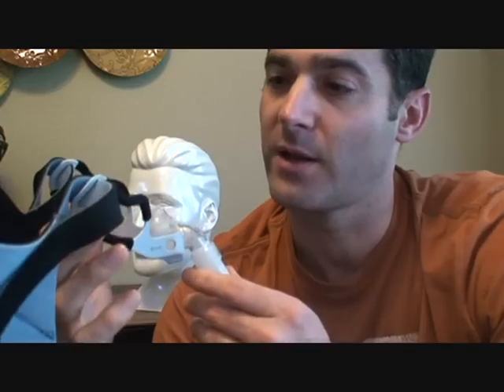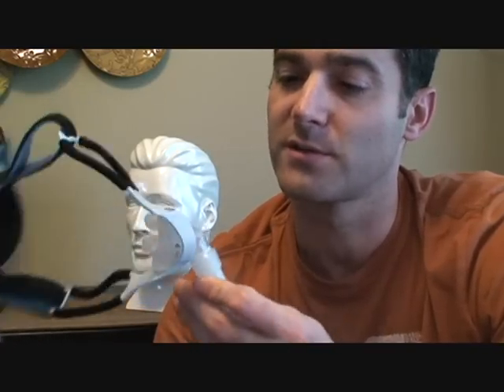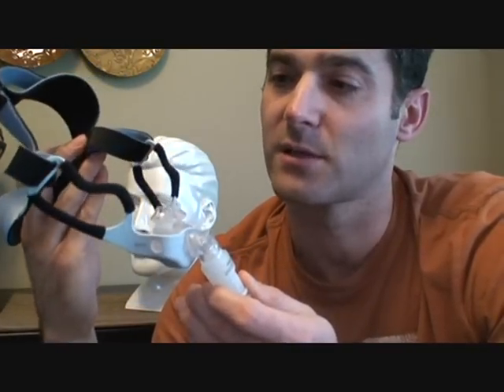Hi, my name is Jason. I'm a registered sleep technician and I wanted to do a quick review — mask fitting, placement, and how to disassemble and reassemble the Respironics GoLife Nasal Pillow Mask.